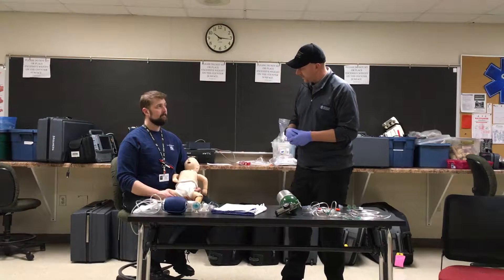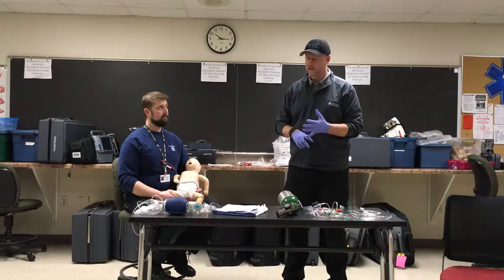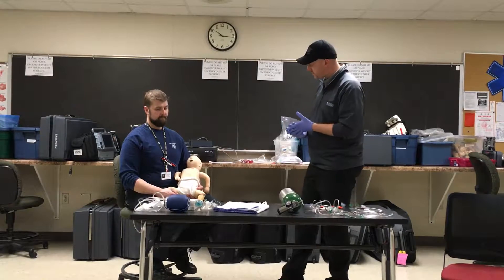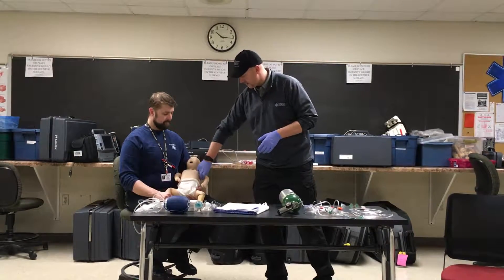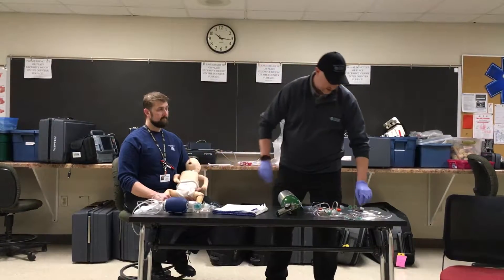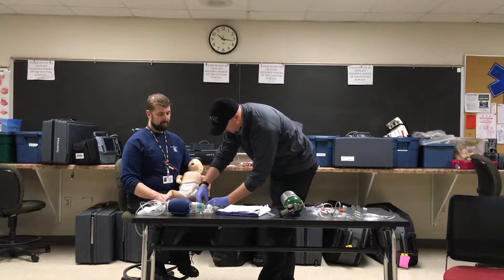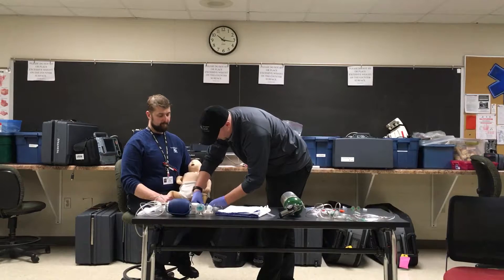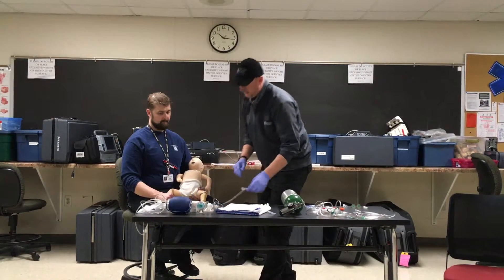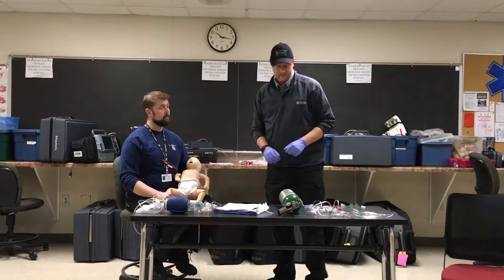We're going to assess breathing — look for chest rise and fall to see if we see anything out of the ordinary, any chest excursion, and audible sounds. Then we'll check perfusion. We can assess for a pulse, but because we have difficulty breathing, we're going to attach a pulse oximeter to the pediatric patient's foot. Our examiner will then inform us that the pulse oximeter shows a saturation of 82%.